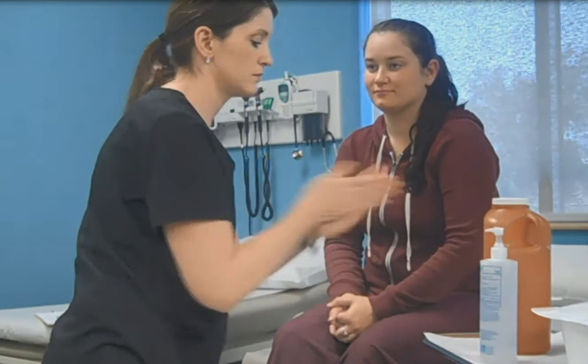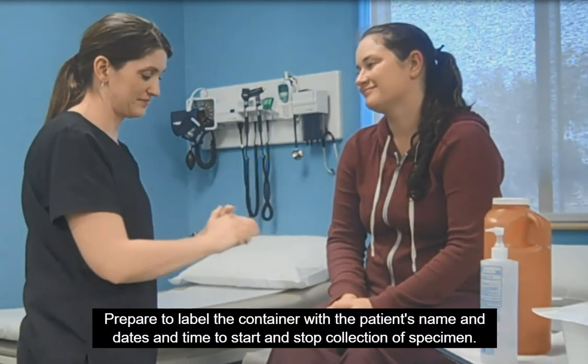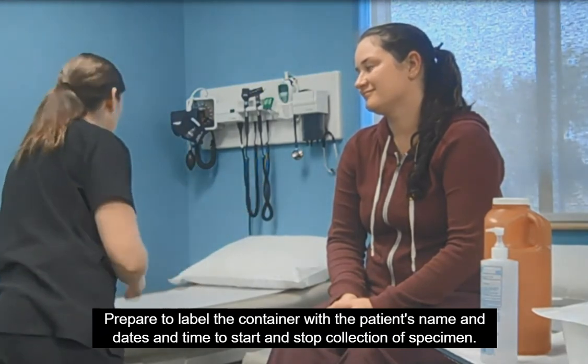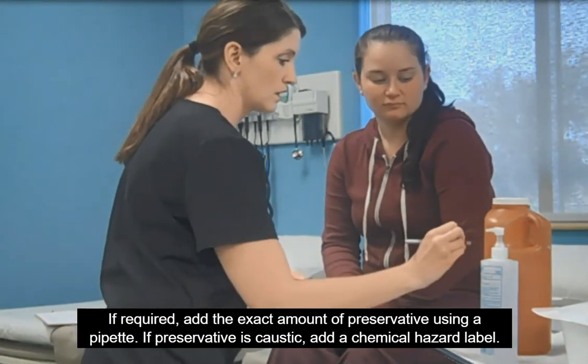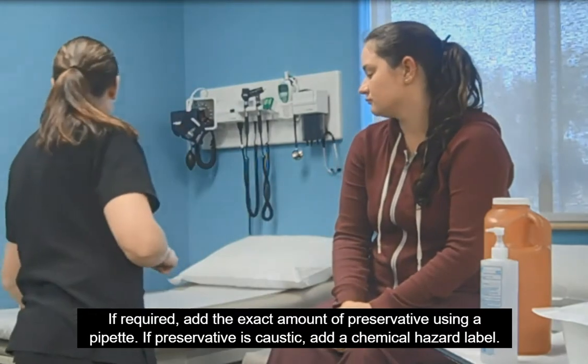Perform hand hygiene. Prepare to label the container with the patient's name and the dates and times to start and stop collection of the specimen. If required, add the exact amount of preservative using a pipette. If the preservative is caustic, add a chemical hazard label.